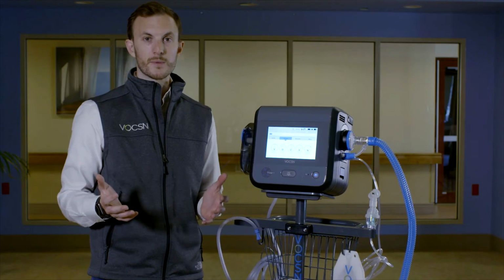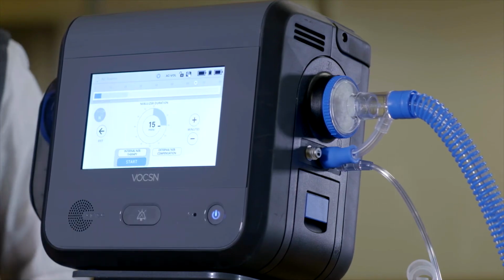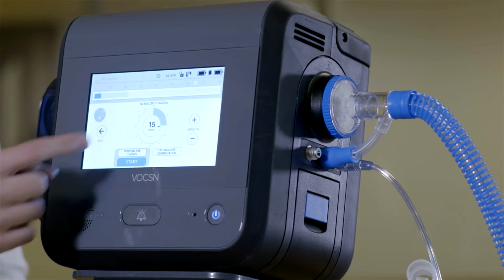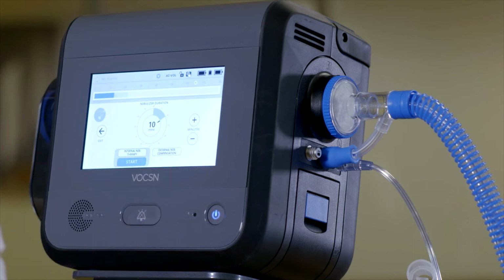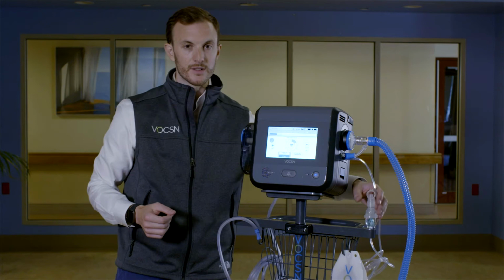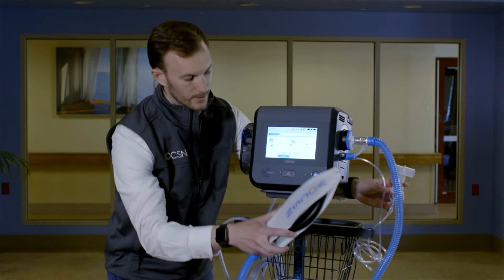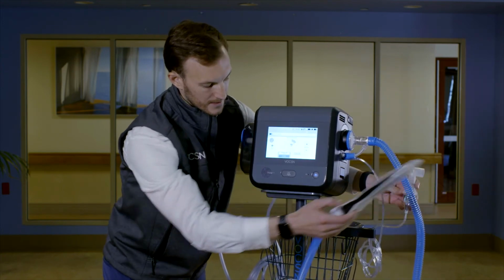Our final therapy is our high-performance nebulizer. Simply hit N for nebulizer. You can see two things. First, I can set a time duration for my nebulizer treatment. So I can set this to, say, 10 minutes. It was originally at 15. And I'm going to use my typical 6 liter per minute neb cup. This is actually going to go in line with my circuit, proximal to my patient. So this would go just like that.